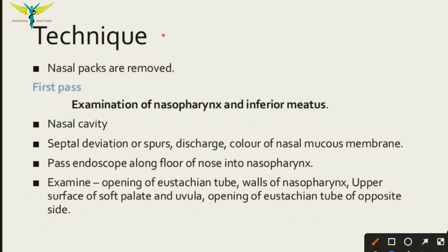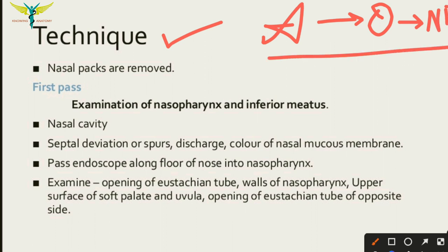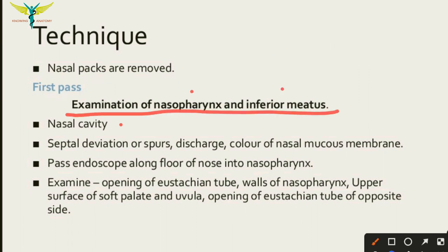Now let's learn about the technique of DNE. After giving local anesthesia, we administer oxymetazoline, a vasoconstrictor, to prevent bleeding. Nasal packs are then placed and removed before performing the DNE. The DNE consists of three passes. In the first pass, we can observe the surrounding structures like the nasal cavity, septal deviation, nasal spurs, discharge, and color of the nasal mucous membrane.